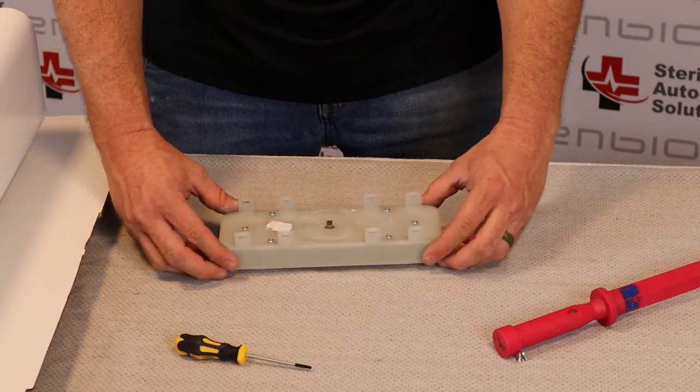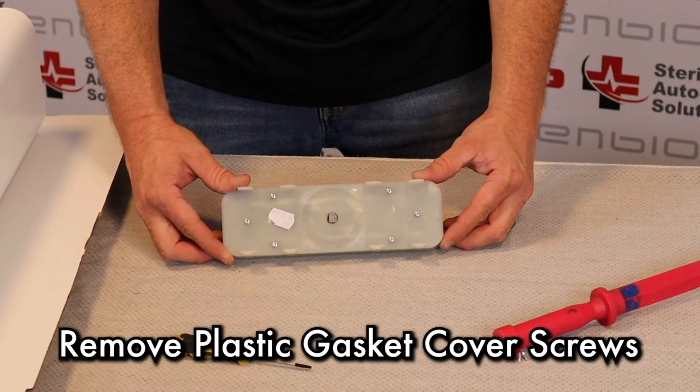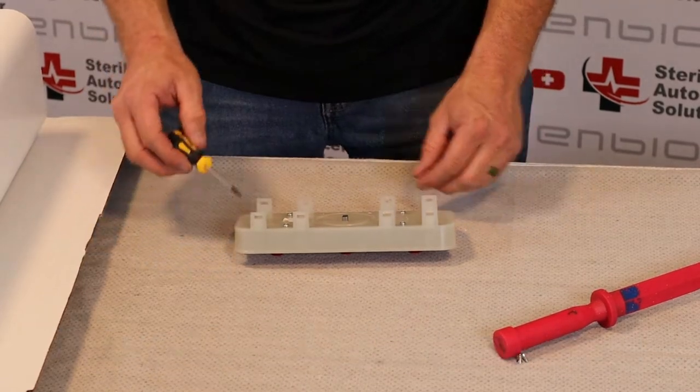Flipping this over, there are six screws. We're going to remove all six screws.